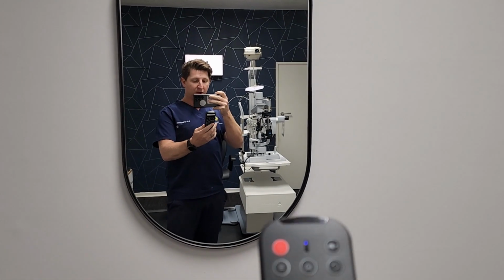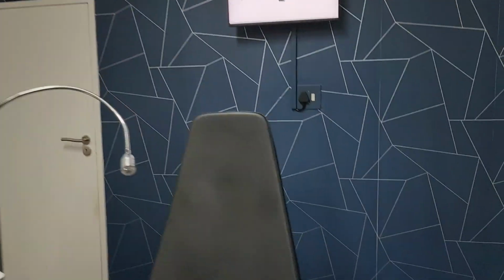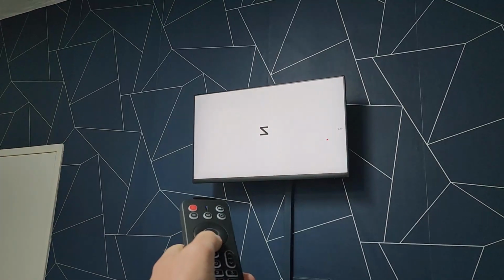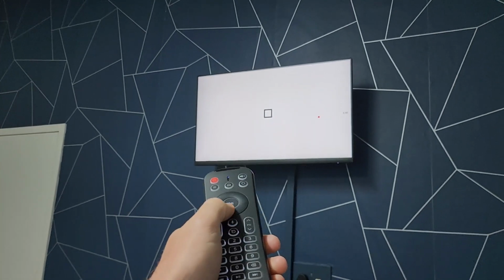So a few people have asked me about my visual acuity chart, which you can see there. It's based on the mirror, so there's a chair, mirror, wall. This here that controls it, you can see I can just go down like that. It's got a little red pointer as well you can use to move around. And obviously you can change it to letters, symbols.